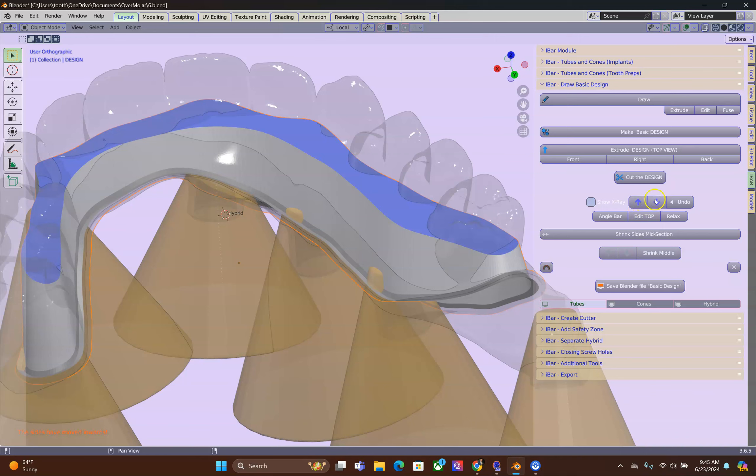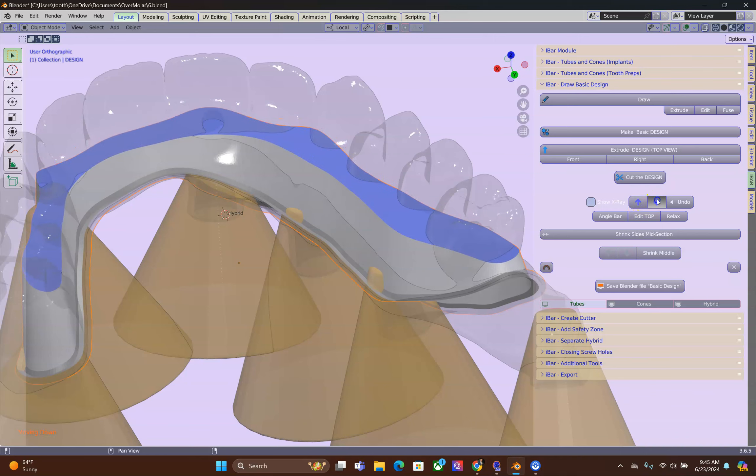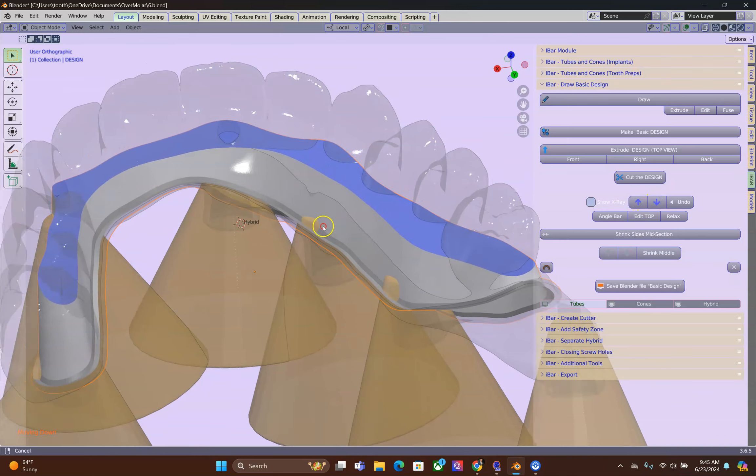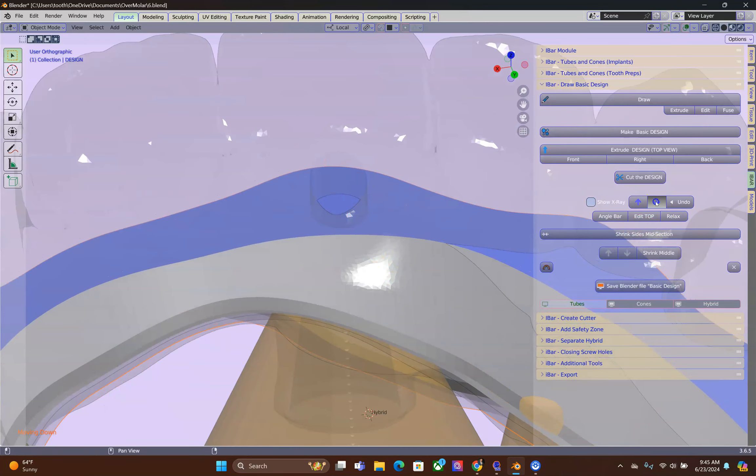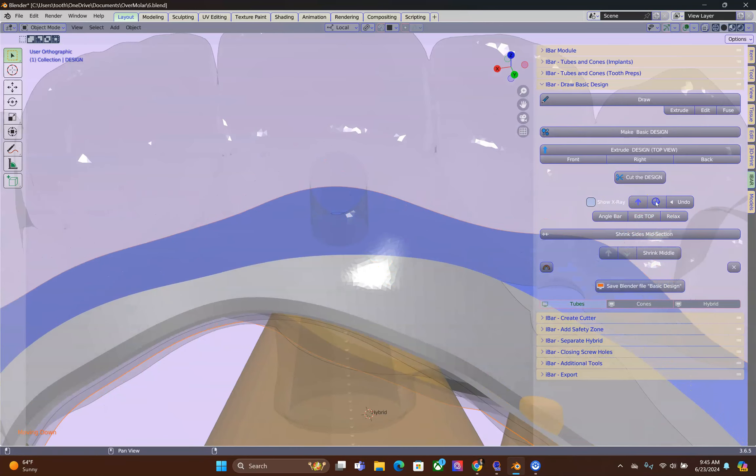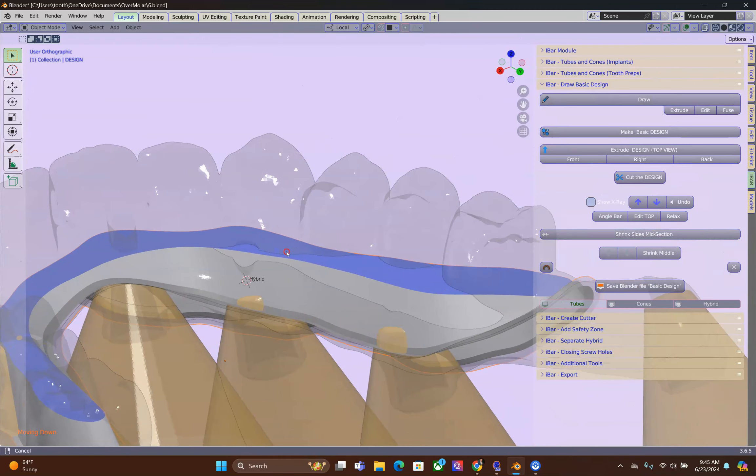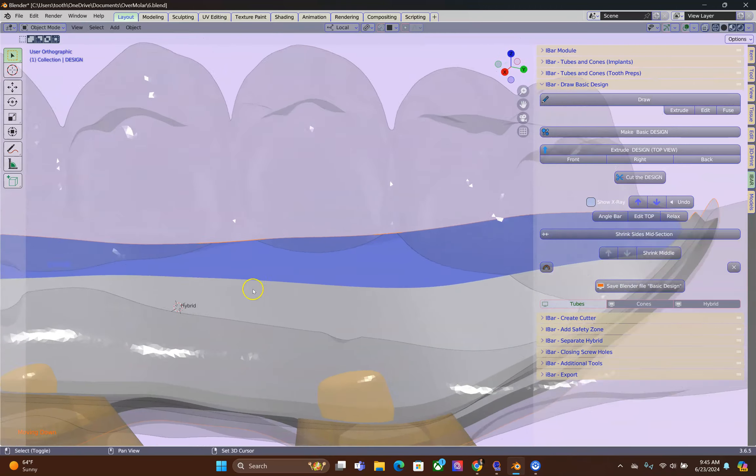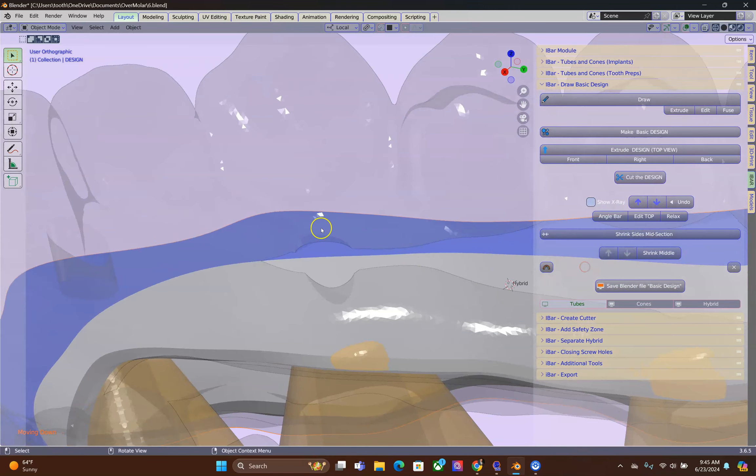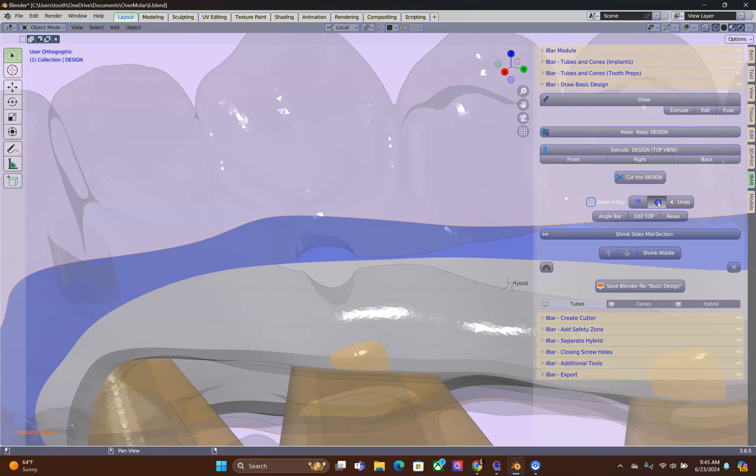Then we're going to move the blue surface downwards. It is safe to do so. Look at where the implant hole is. And then we're going to lower this. Especially in this region.